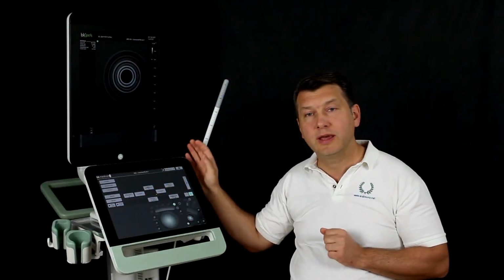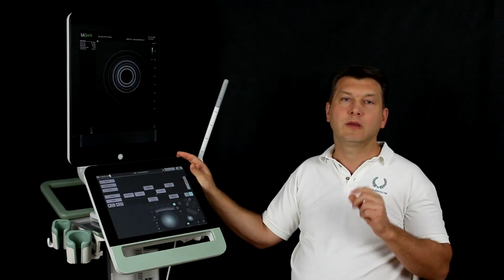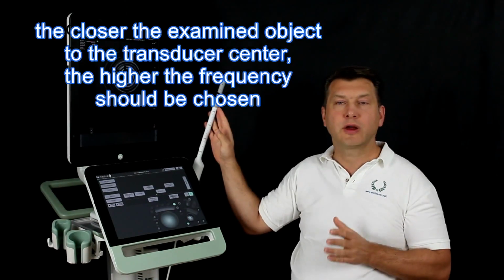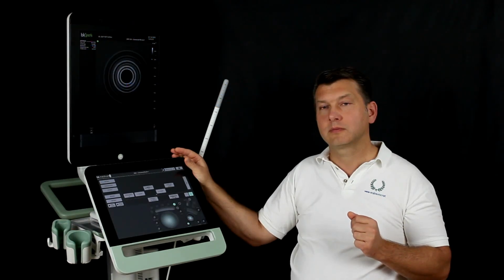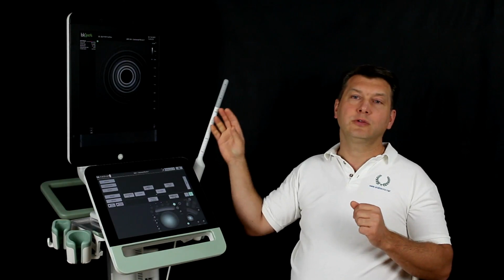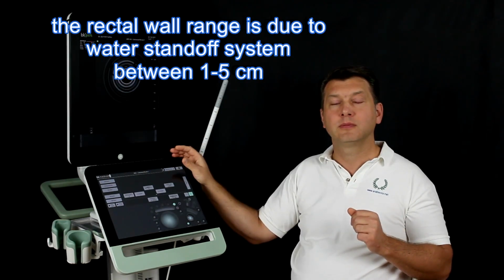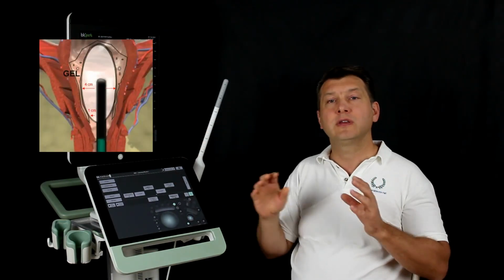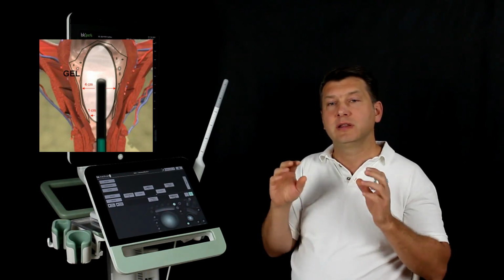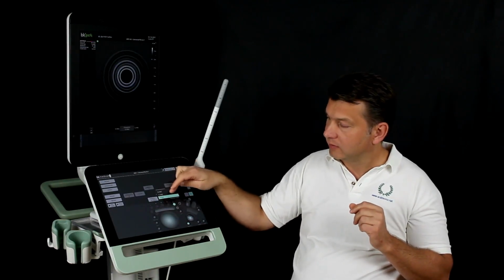Why should we use exactly these parameters? Frequency. The closer the desired structure to the transducer, the higher the frequency should be chosen. Due to the balloon pressure, the rectum wall is in the range between 1 and 5 centimeters. And we need a maximum high image resolution. So the frequency should be chosen as high as possible. 16 or 14 MHz are the best possibility.